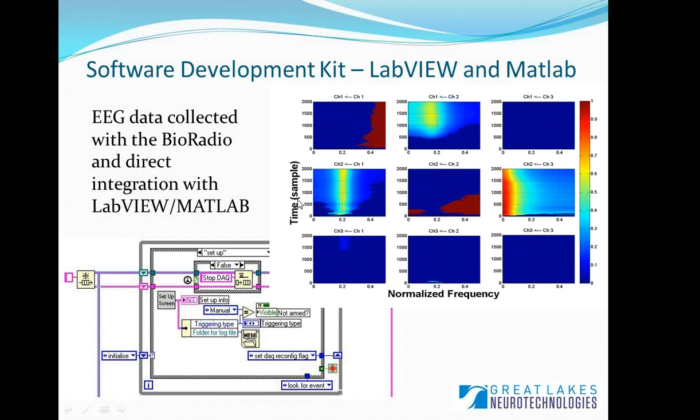The time is here on the y-axis, and then the power or the amplitude of the EEG signal is identified by color. So this might also be referred to as a waterfall plot. So this gives you the opportunity, instead of just looking at amplitude over time or frequency analysis, you can look at all three components, time, frequency, and amplitude, in one window, really.